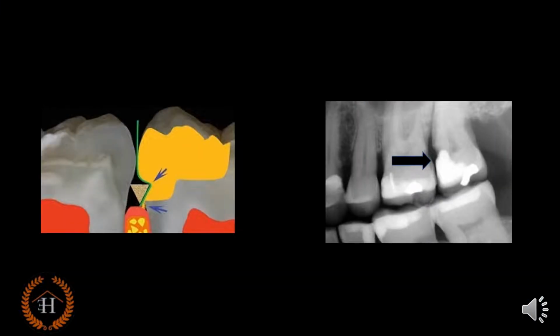To illustrate this, let's have a look at this picture. When the caries extend subgingivally and you try to adapt a band in that region, that band will leave a ditch below the restoration, as you can appreciate in the image towards the right. Despite having good proximal contacts built up, there is a marginal ditch below the restoration which leads to marginal leakage and failure.